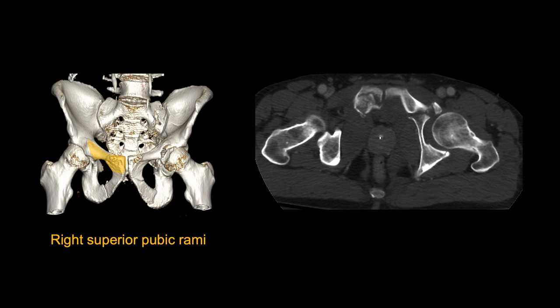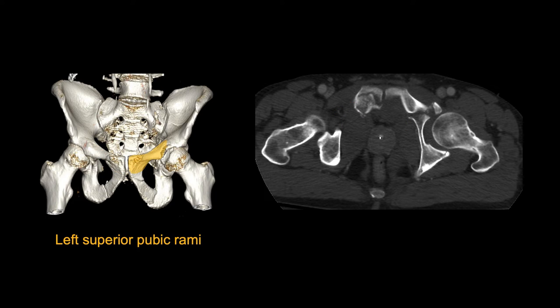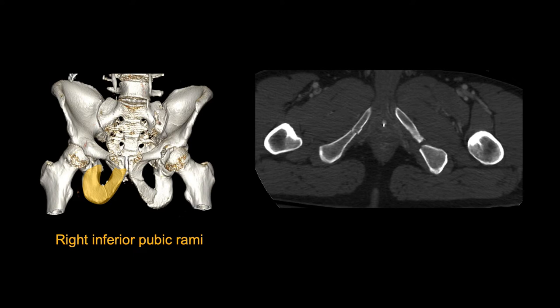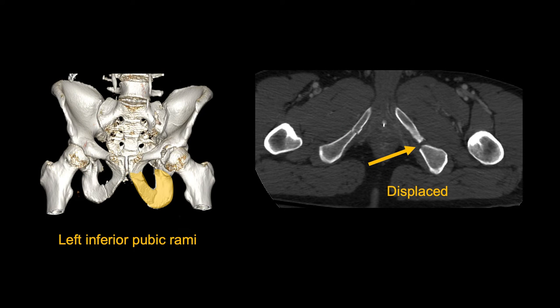For the superior pubic ramus injuries, the right side involves part of the pubic body, while the left side is higher and involves the anterior acetabulum. For the lower pubic ramus, the right fracture is relatively subtle with a thin cortical defect, but the left fracture is displaced and slightly offset.